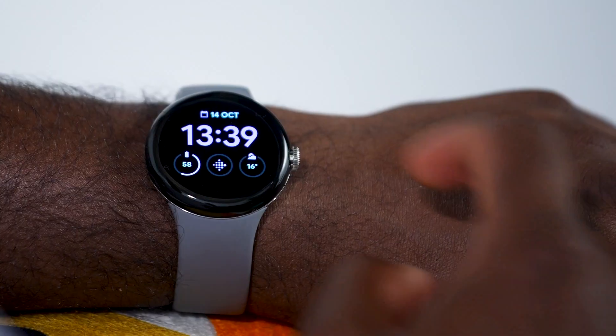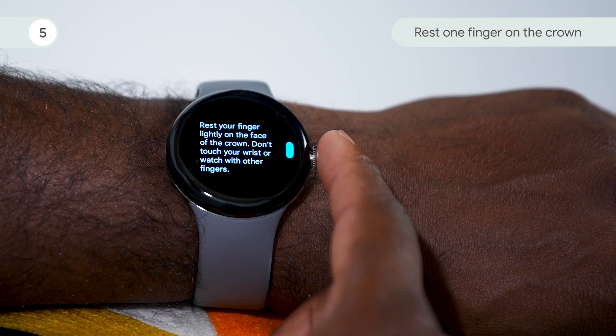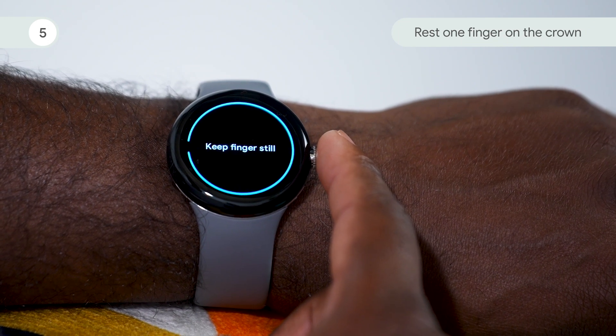Find a comfortable place to sit and relax. Make sure your watch is one finger width below your wrist. Open the ECG app on your watch and tap ready. Select the wrist your watch is on. Take one finger and lightly rest it on the crown, making sure that your other fingers don't touch your wrist or the watch.